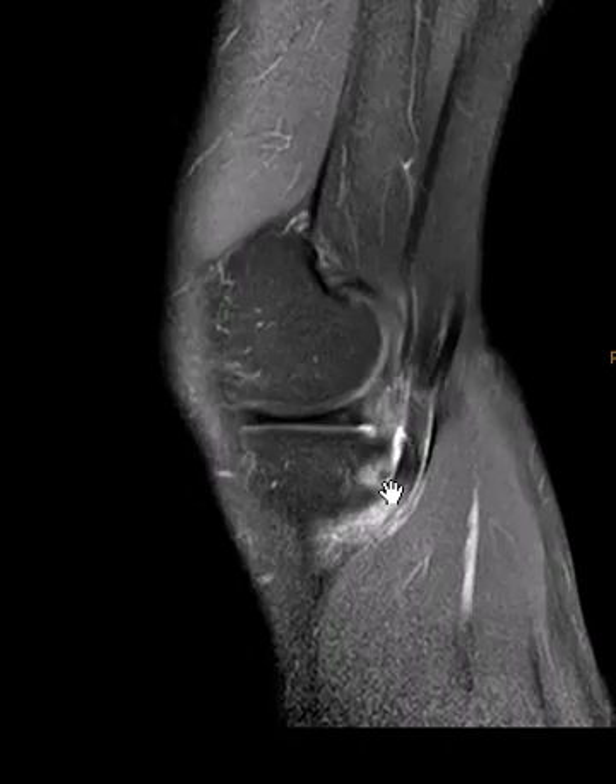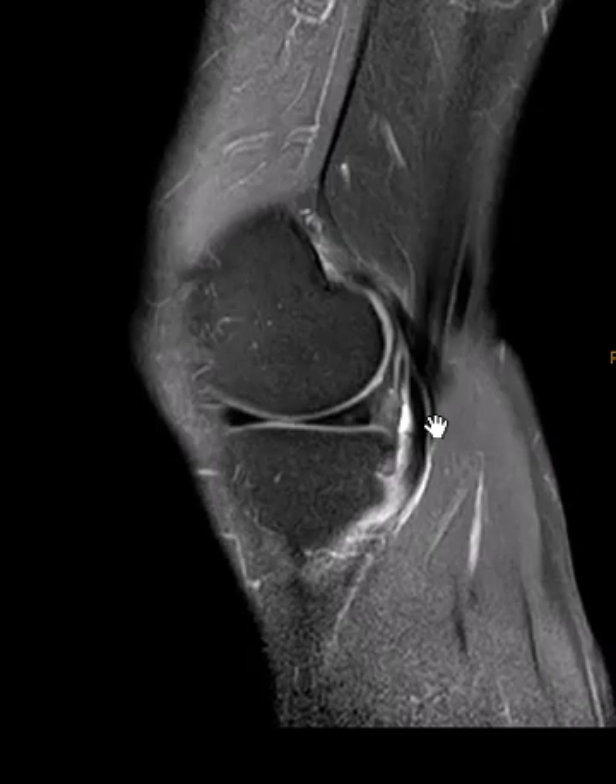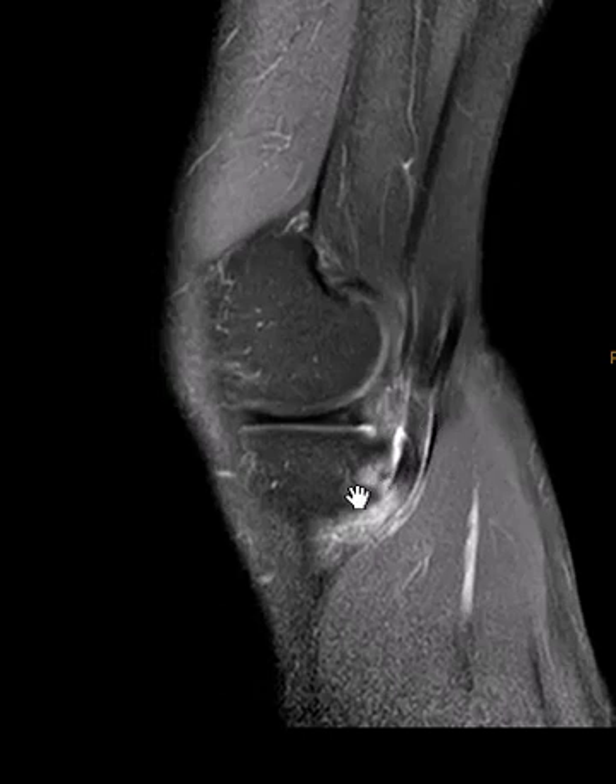And here we go again — it's stripped off and pulled back a little bit. But it really is best seen in the axial images. So an isolated tear — this is the second one over the last couple of weeks — of the semimembranosus tendon at the attachment to the tibia. Thank you very much.